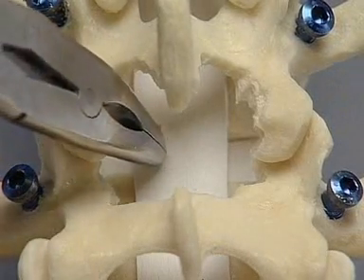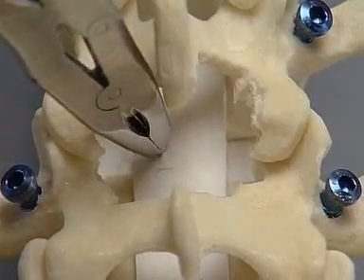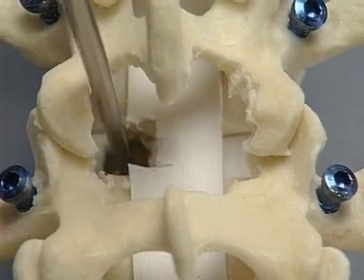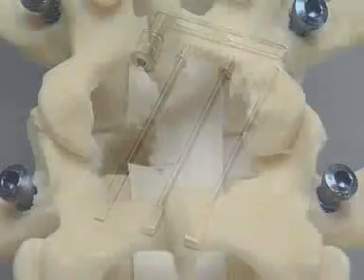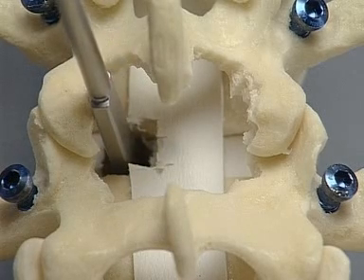A pituitary rongeur is used to remove the disc; the anterior annulus is preserved. In a clinical situation, the end plates are then prepared with the square-ended curette. It is important not to remove the end plate but to remove the cartilage to ensure that the end plate is clean and bleeding. To open the disc space, the disc space opener and the vertebral body spreaders are used. The 14 and 15-millimeter spreaders have been chosen for this exercise. The disc space is opened first with a small disc space opener which is rotated to enlarge the intervertebral space.